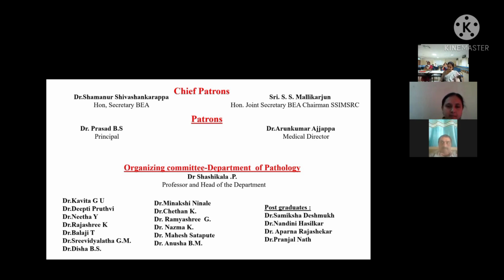Dr. Sonam is a pioneer in adnexal tumors. Today she will be taking on the pilosebaceous unit. It is a proud privilege to welcome Dr. Sonam to this slide seminar.